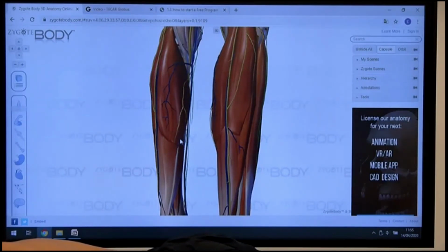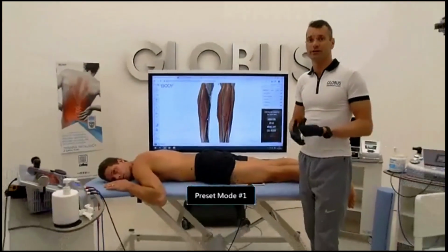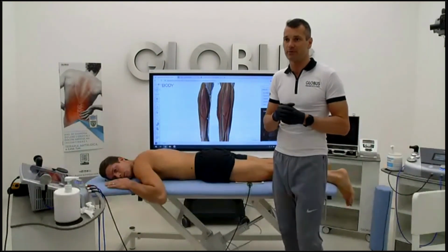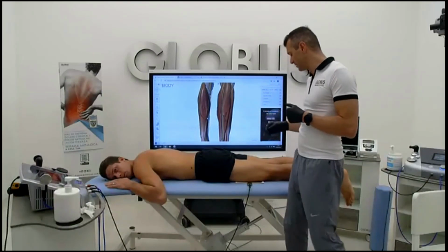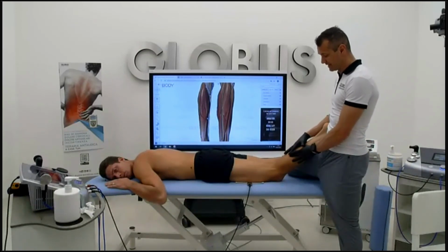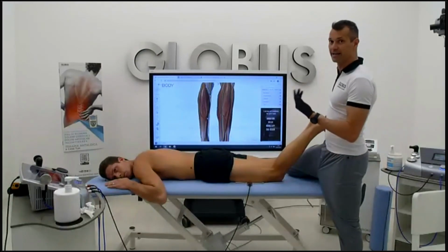I don't know who of you uses ultrasound diagnostic imaging during day-by-day practice, but it helps a lot, also for that question of Nancy about the chronic rupture. Just putting the echograph here, you have a clear vision of what is happening under the calf, and you can show the patient before and after the treatment.